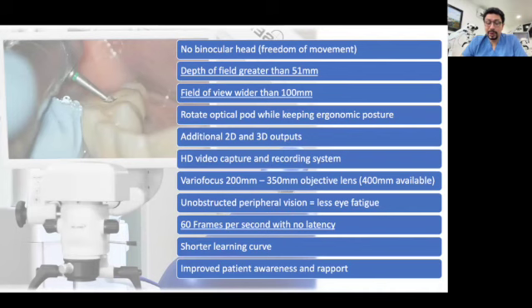And most important, we already talked about negative and positive 3D vision. It's quite important, guys, to check that the microscope that you are going to use does not have latency. If you buy a 3D microscope, and it has latency in the transmission of the images, it will be impossible to work with, because your brain will collapse and you are not going to feel comfortable working.